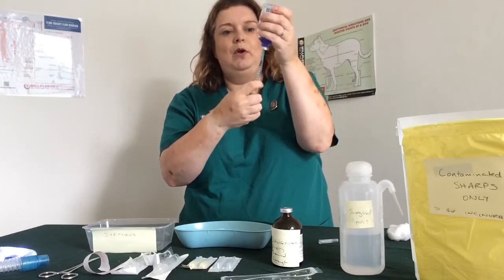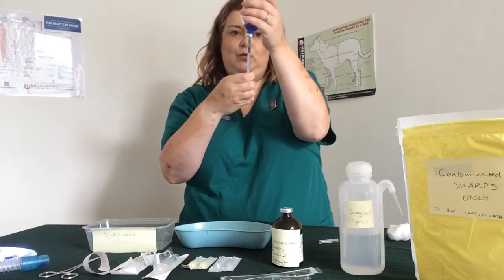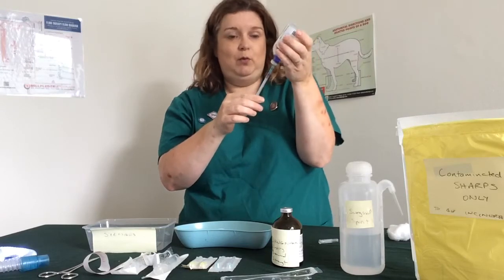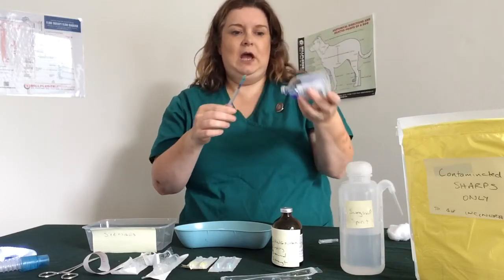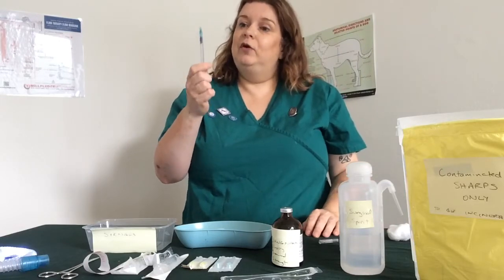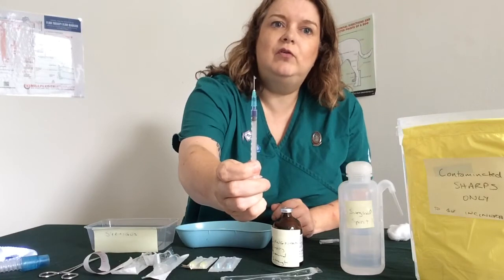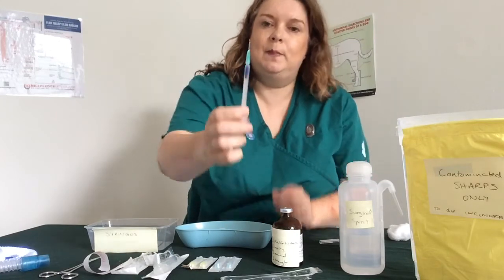I'm going to draw up 0.1 to make it nice and quick, and as you can see I've put in coloured water, and that's a good thing to practice with if you're worried. I'm taking it out, and we need to change the needle. We know that needles get blunt, so you're going to have to draw back because you do not want anything in the hub, so you can see the colour change, draw it back.